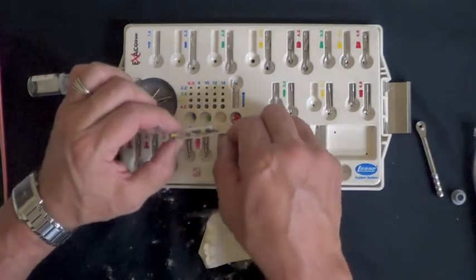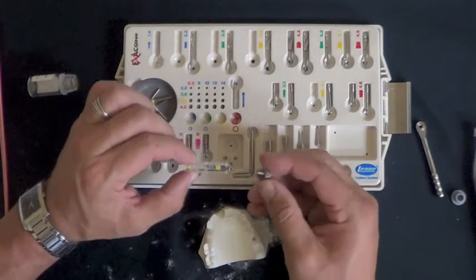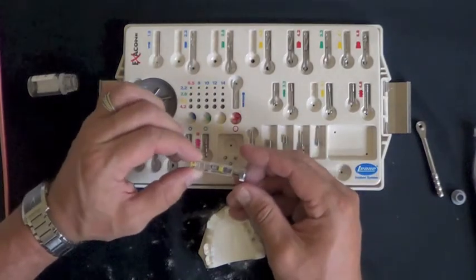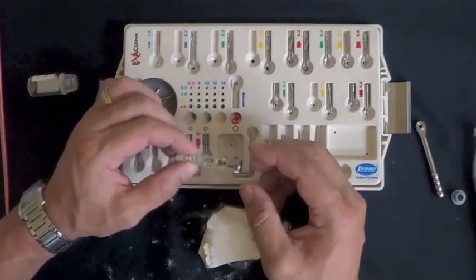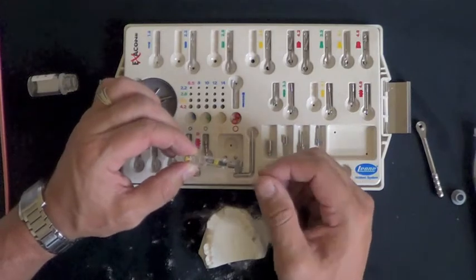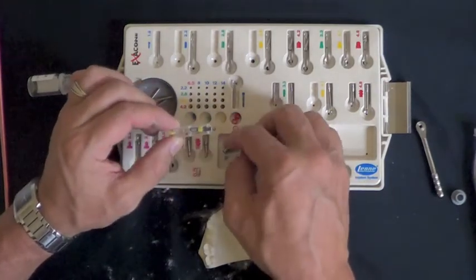If you want to use hand-driven, you can attach this to your implant, your thumb knob, and place it that way. Simply remove it from the container and screw it into the osteotomy site.